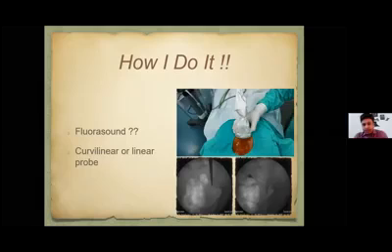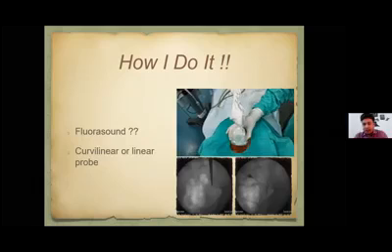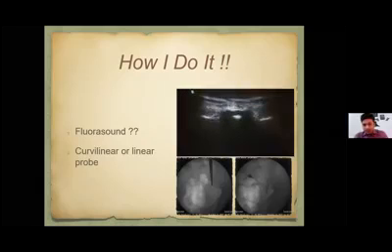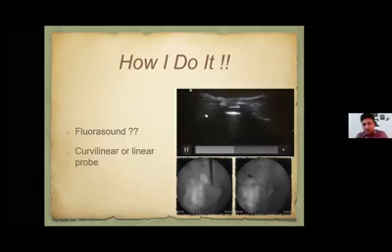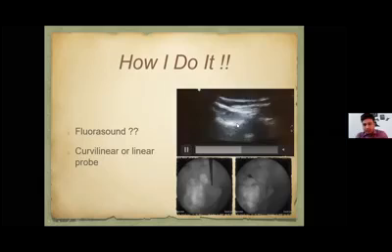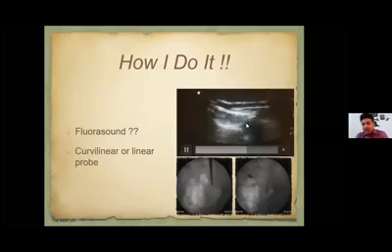This is the down-up technique that I am showing. We move the probe in the transverse view from the downside in the midline, and then we move laterally where we propose to do the intervention. Here you can see the sacral hiatus, and then the sacral cornua, and moving up, the midline sacrum. You have started appreciating the lateral crest of the sacrum now. With a little bit of movement upward, you will start seeing the ilium, and when you start seeing the ilium, you are in the inferior portion of the sacroiliac joint.